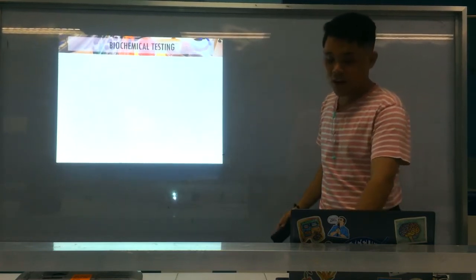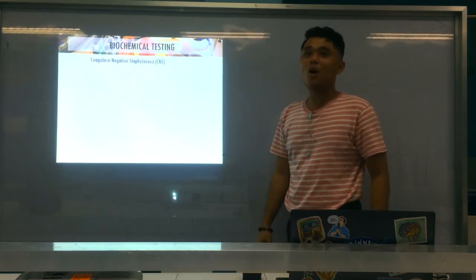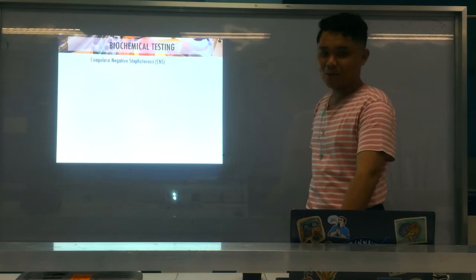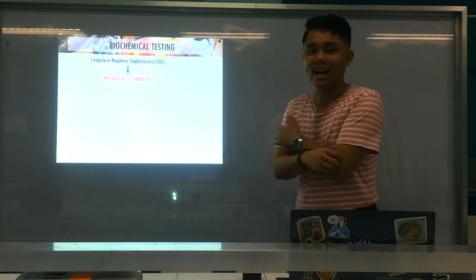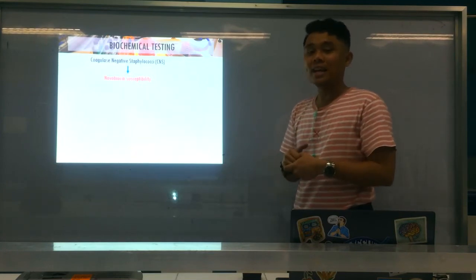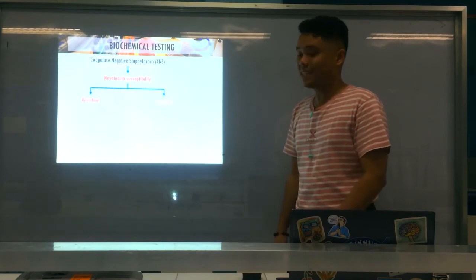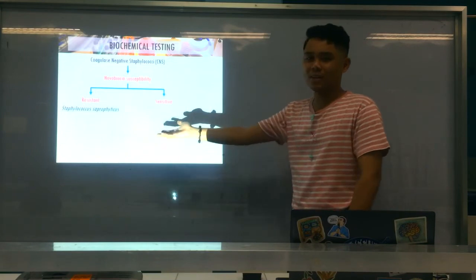Now, we now go to your coagulase negative. All right. So, of course, dili na to kalimtan ang mga coagulase negative because, again, they're also very much important. Right? Okay, so we'll start first. The next step to perform if coag negative siya, like sa tube coagulase negative, we now subject it to novobiocin susceptibility test. And if it's novobiocin resistant, then that is your Staphylococcus saprophyticus.